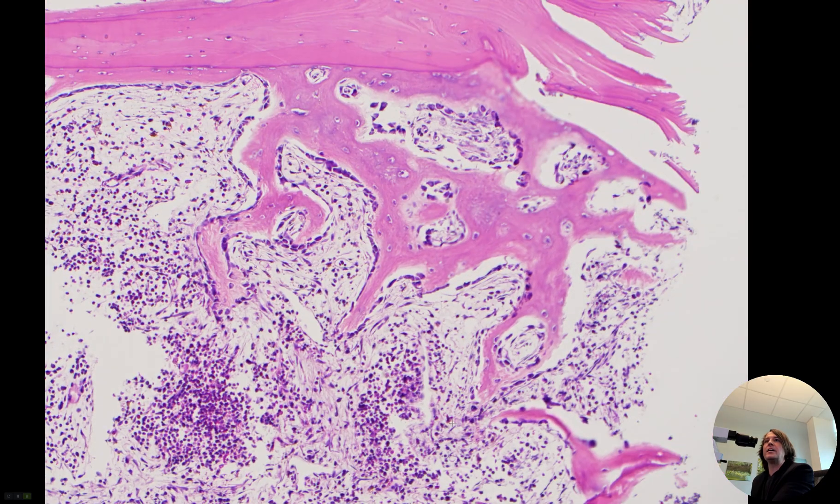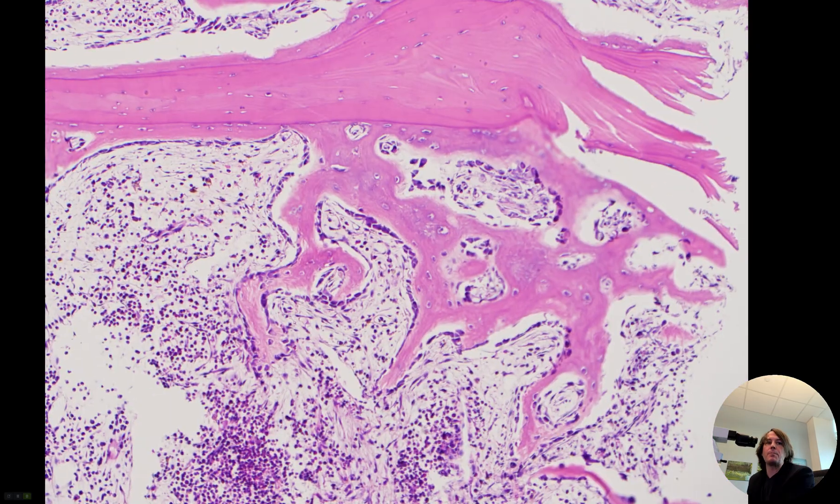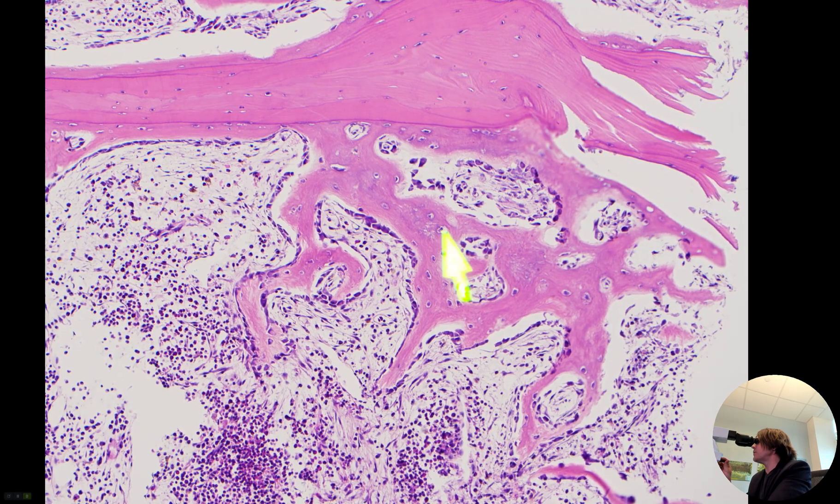What's happening right here underneath it is a fracture repair, or fracture callus. In this case, in the spine, it's not making a full grown callus, but this is the same process that would happen if you broke your femur or your humerus or one of your long bones in your arms or legs. What's happening is this stuff is woven bone.